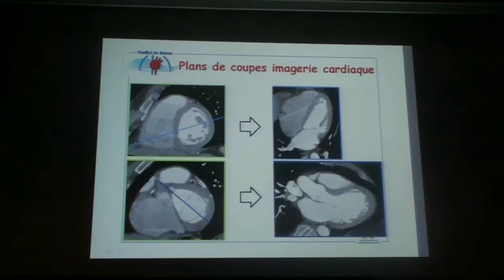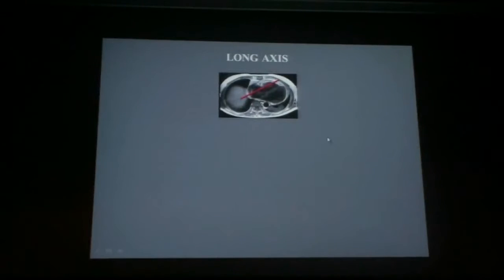So if you want to study aortic valve insufficiency at the same time as mitral valve insufficiency, or together with maybe a thickening of the septum, this is an excellent orientation. So let's move to MR. What do you do with MR?